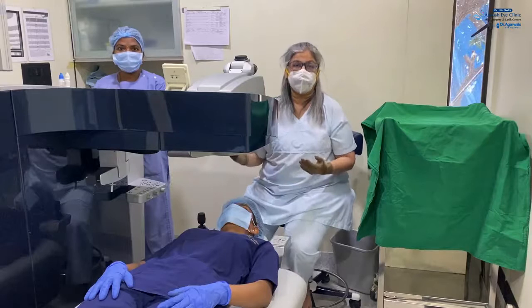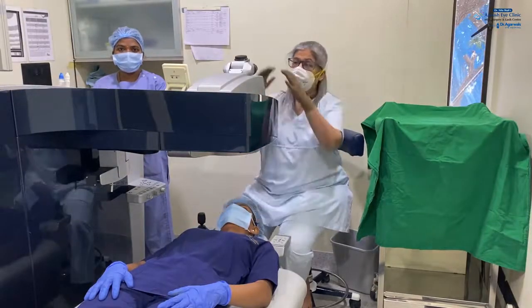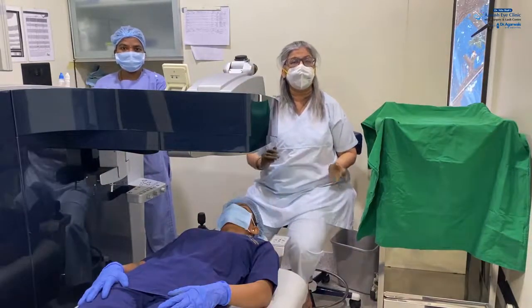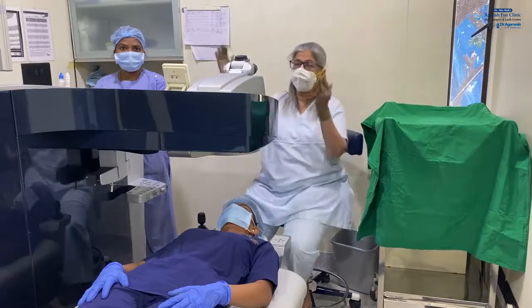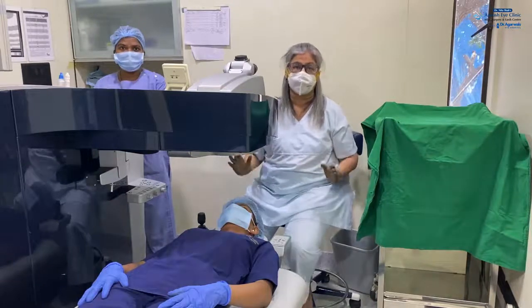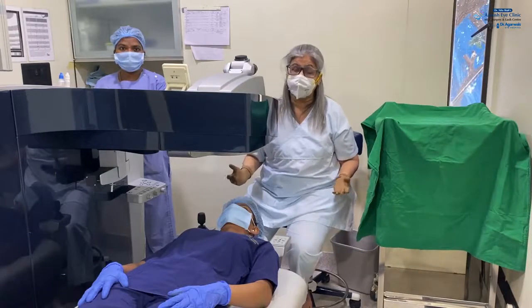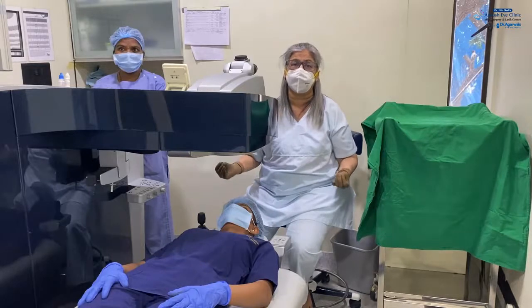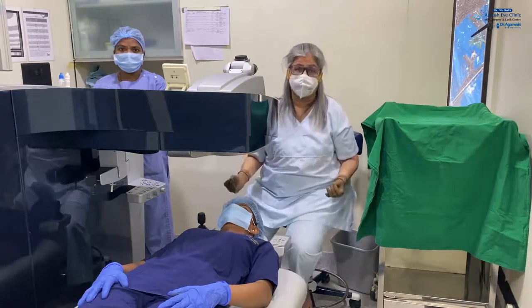Now we have taken the patient into the operation theatre. All the planning is completed and we will be carrying out the laser with the laser machine inside. The treatment would take us around 5 to 7 minutes per eye, because all the data has already come into the machine, all the planning is over, all the checkups are done. There is no pain, there is no injection, and there is no patch. They would just feel that something is being done in their eye, some sensations, but zero pain.